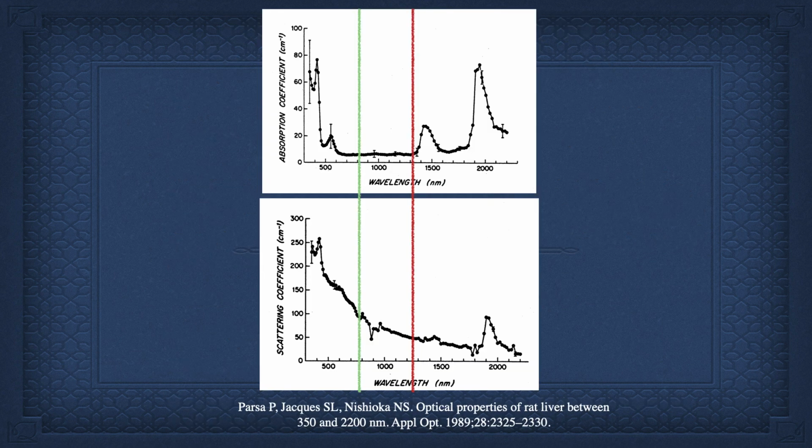So if it wasn't for this slide, which wasn't done by our group, it was done by a different group, but I had seen it. This was part of the quest to go after non-transparent tissue. The problem was we didn't have a technology to visualize vulnerable plaque. And OCT seemed to have a possibility, but the green line shows absorption and scattering with an ophthalmologic system.